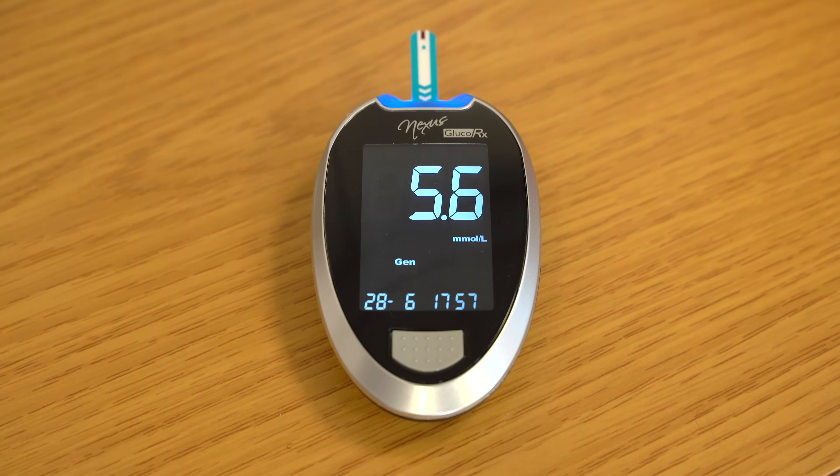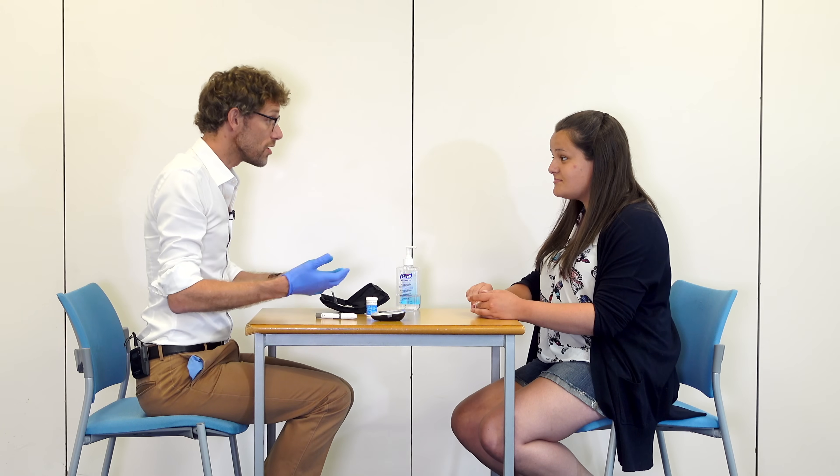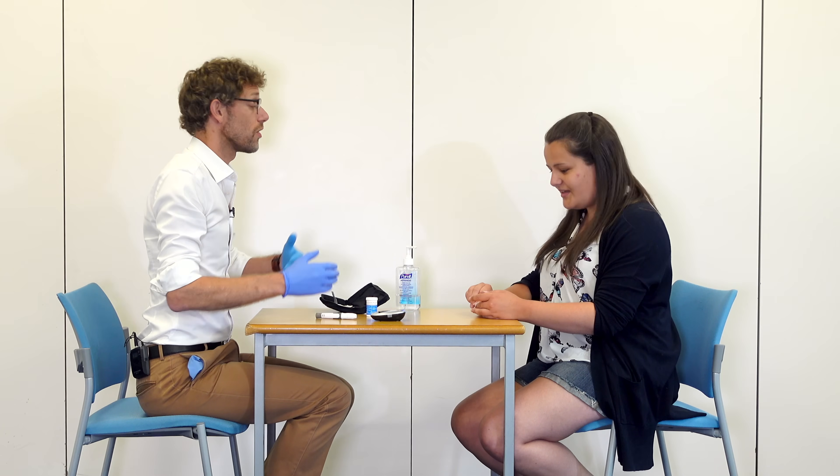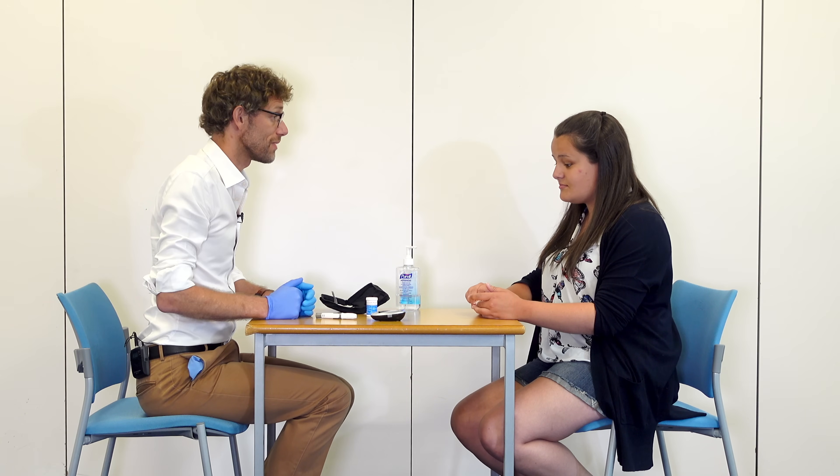So we've got 5.6 — that scores fine. Whilst we do have that diabetes that we're worried about, we do know that at the minute that number is excellent.